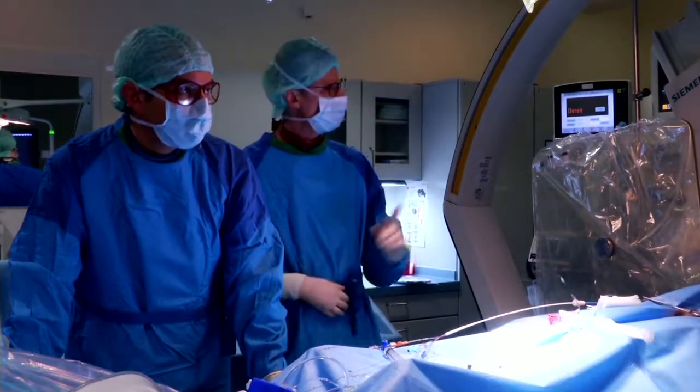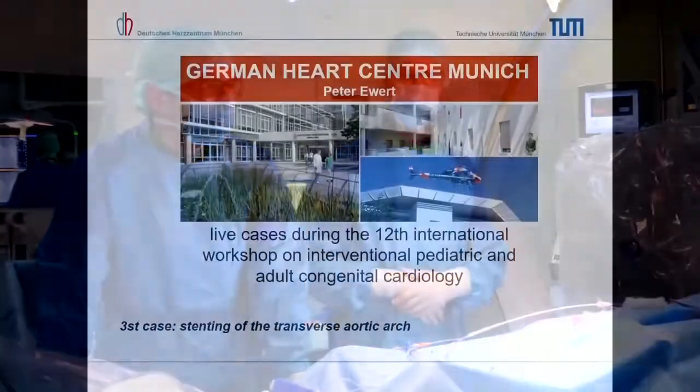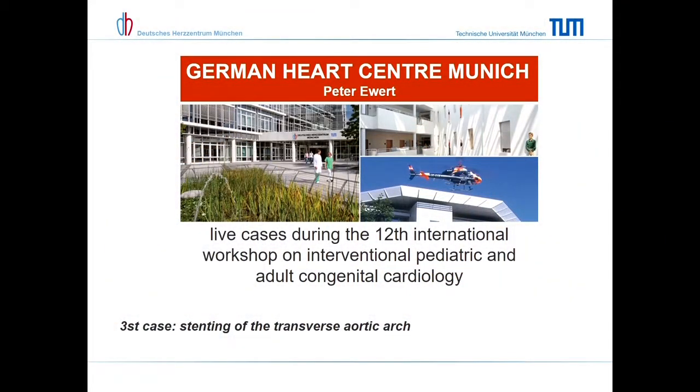So you can see the PowerPoint slides, please. Yeah, thank you very much. This is our third patient. He also has a coarctation like the last one. Can we see the second one, please?